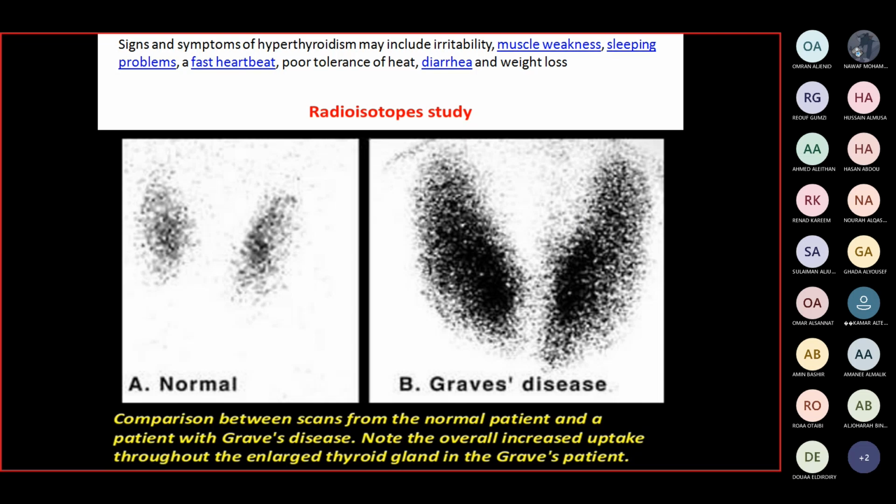Any pathology has a specific appearance. For example, if there is a nodule, it could demonstrate high uptake, low uptake or no uptake. We can even build a differential diagnosis according to this appearance, whether there is increased uptake on the nodule, decreased uptake, or low uptake altogether. I'm not interested in talking about this at this level.